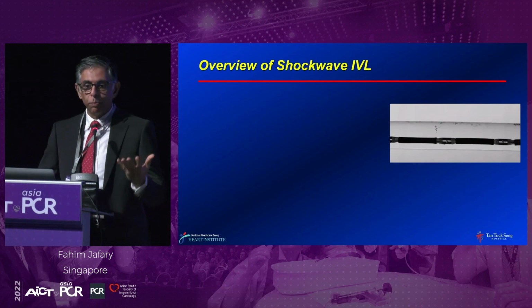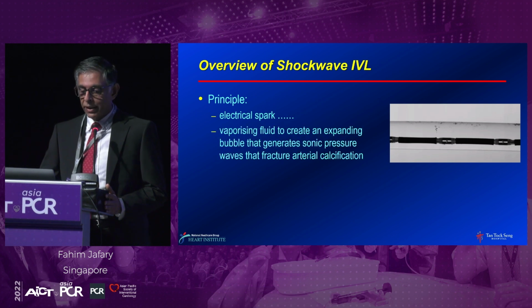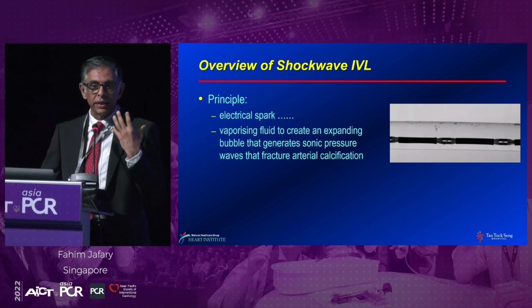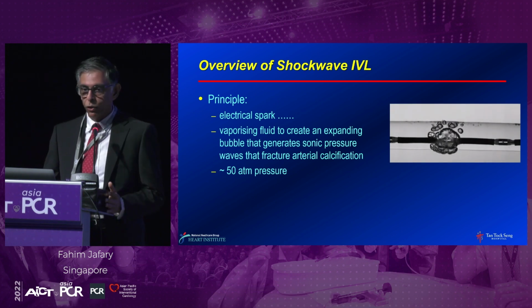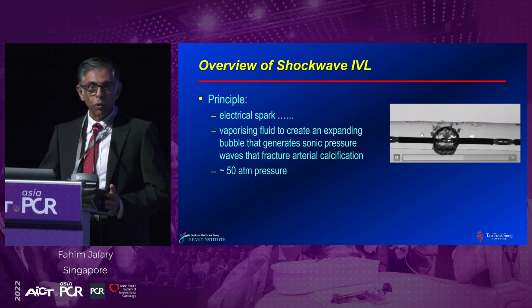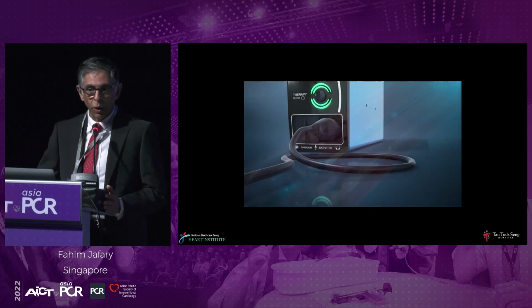You've already heard briefly the overview. The basic principle of shockwave lithoplasty is that essentially you produce an electrical spark in a balloon, and what that does is it vaporizes the fluid and creates these acoustic shock waves that pulverize the calcium and induce fractures, both microscopic and macroscopic, at about 50 atmospheres. And you can see on this panel on the right side this literal grenade explosion in the balloon that produces these acoustic shock waves. And you've seen this video already. Ashok was just showing it to you.